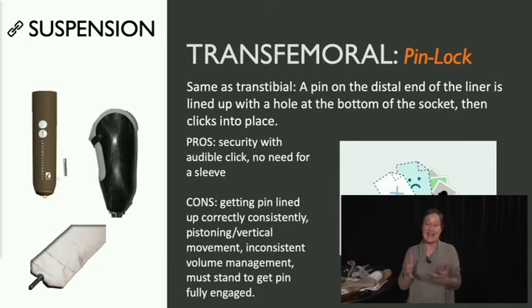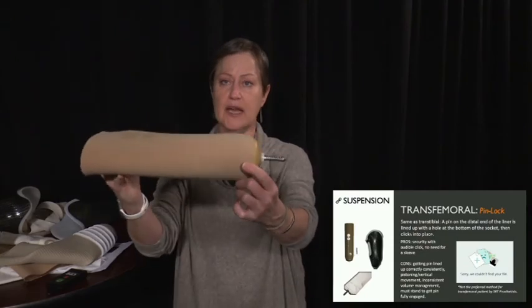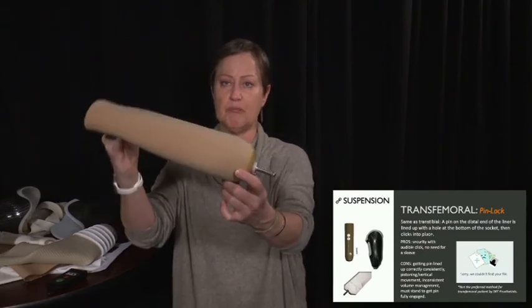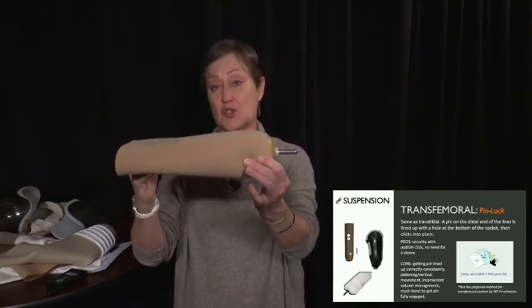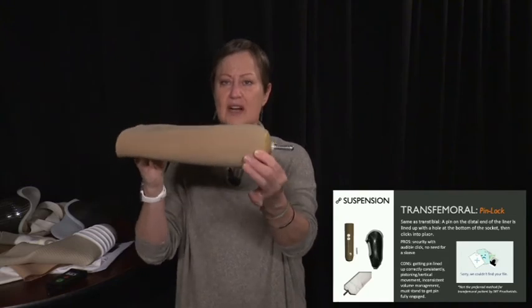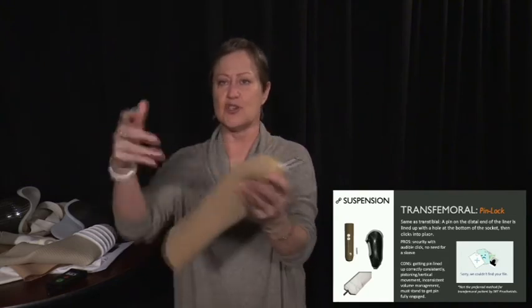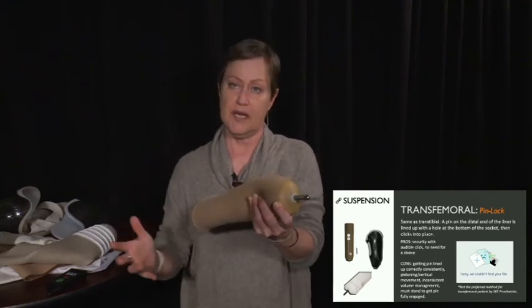But that said, you might find that your local prosthetist might have a reason why they will do it for a particular patient. The problem that I've seen years ago when it was pretty common is that when people are donning that liner, having that pin pointing up or pointing down, really common. And that's true also for the trans tib folks. So they would put the liner on. They couldn't really tell where the pin was. They try to get the pin in the hole in the socket. They're all over the place.